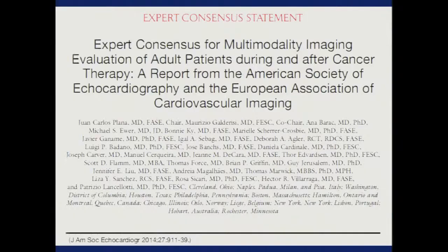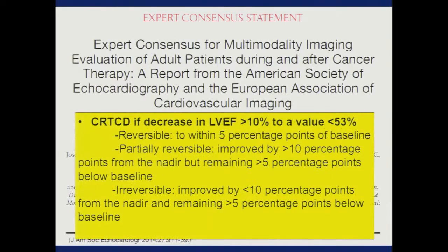Here's an expert consensus statement document from the ASE. This was published before the exams were written, so perhaps it's worthy of us to look at what they had to say, because this is a very emerging field in myocardial imaging. And they talk about cancer-related treatment cardiac dysfunction: if there's a decrease in the EF of greater than 10% to a value of less than 53%.